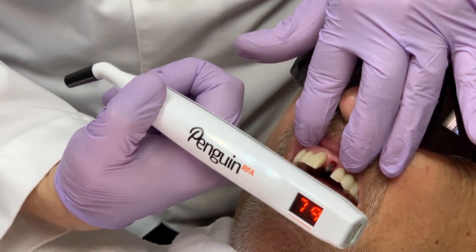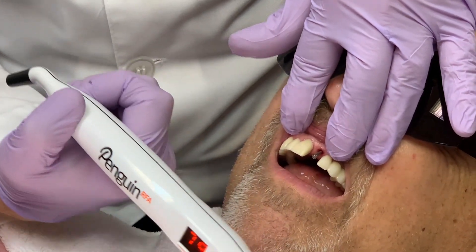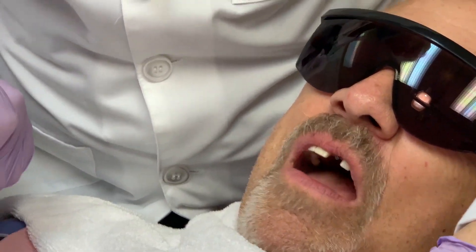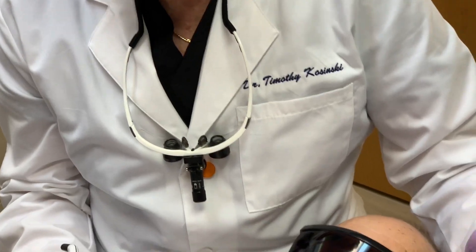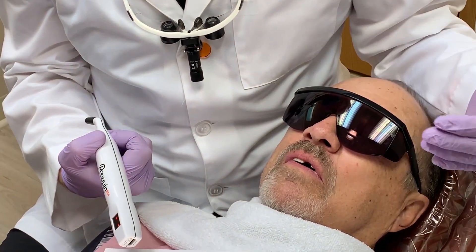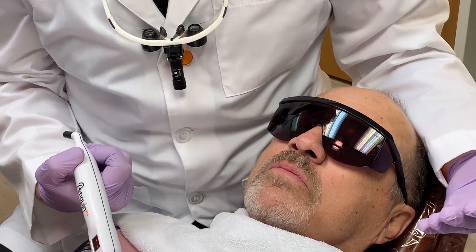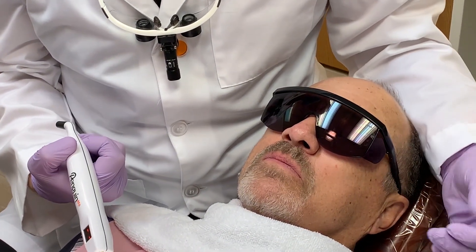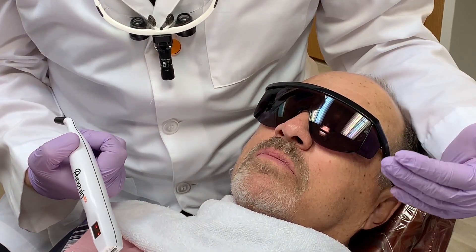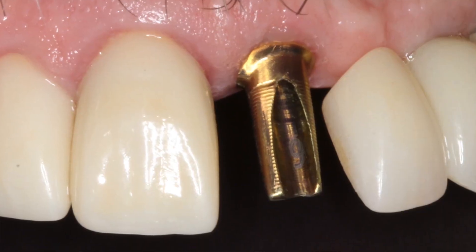The stability of the implant is indicated on an ISQ scale of 1 to 99. By taking a baseline value at implant placement, it gives us a great relationship regarding osseointegration. Generally, values above 70 indicate a very stable implant with low micro-mobility that can withstand normal function forces in the mouth. This confirms that loading of this implant is appropriate.